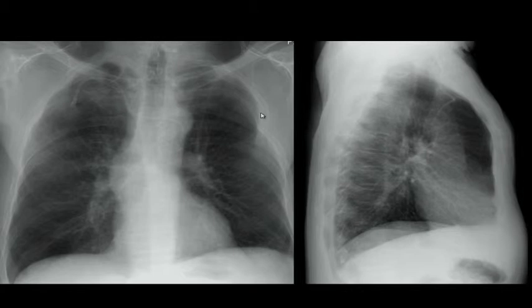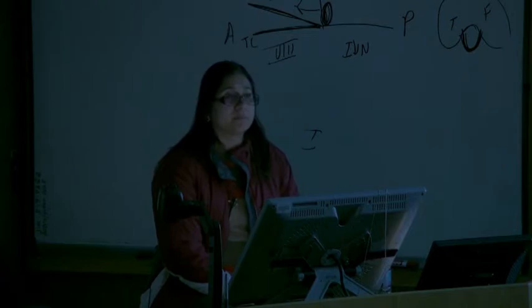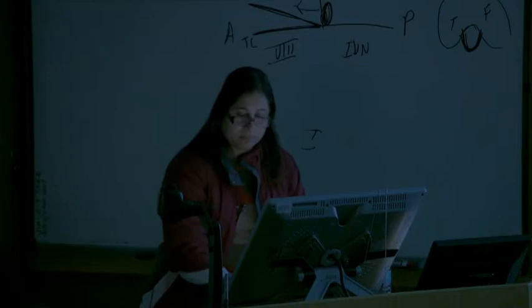What is your differential diagnosis on the X-ray? You have to say something. Always a risk of some sort of superior vena cava obstruction. So maybe in a collateral channel, is that what you're saying? Yes. Okay, collateral channel. But as an examiner, I will tell you that the patient didn't have a puffy face, a puffy neck, or puffy chest wall veins. It didn't seem like the SVC was obstructed. So it's in a vein, but on the opposite side, could be in a collateral.